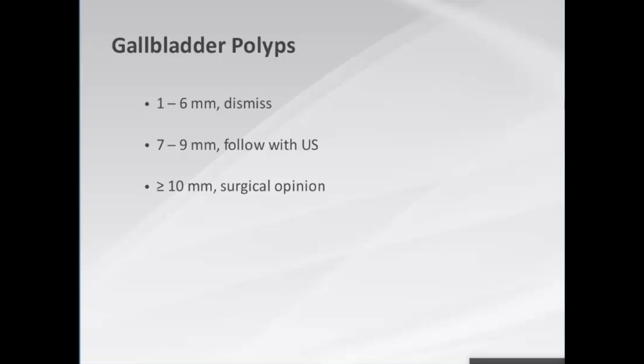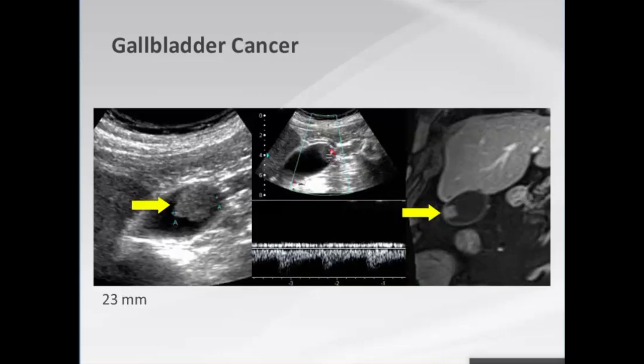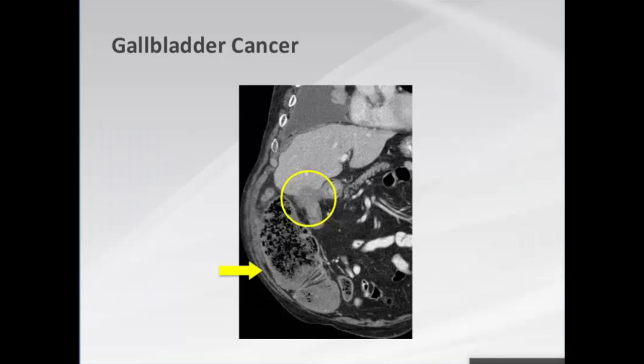Here's an example: a 2.3 centimeter polypoid gallbladder mass with spectral Doppler confirming it as a vascular mass. Strong concern about malignancy was raised. The patient either declined surgery or was lost to follow-up, and returned with obstruction of the right colon from an invasive cancer involving the hepatic flexure, with likely tumor seeding in the paracolic gutter. You must have serious concern when you see larger polypoid gallbladder masses.